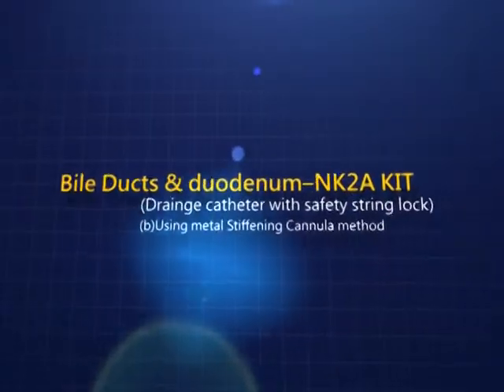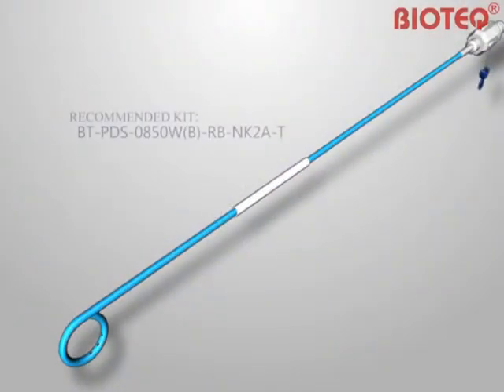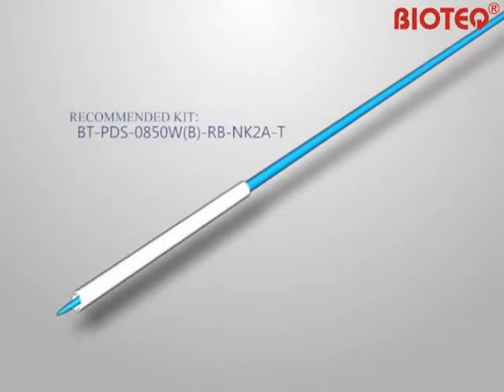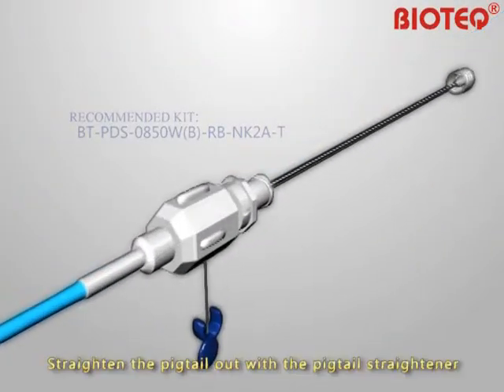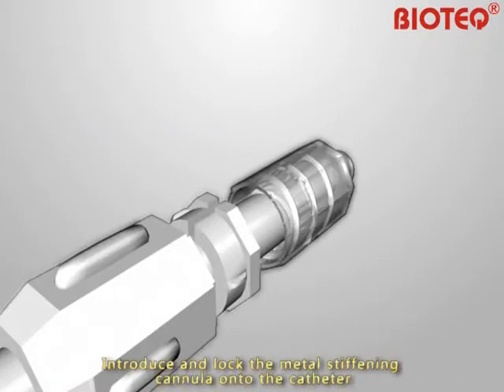Bile ducts and Duodenum NK2A Kit. Using the metal stiffening cannula method, drainage catheter with the safety string lock. Straighten the pigtail out with the pigtail straightener. Introduce and lock the metal stiffening cannula onto the catheter.